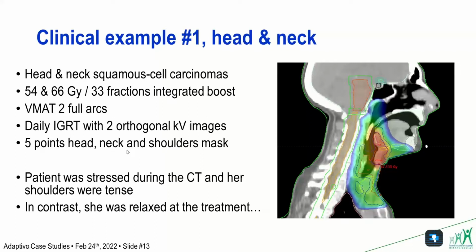The problem with this case is that the patient was very stressed during the acquisition of the planning CT, and her shoulders were very tense. But in contrast, when we wanted to treat her, she was very relaxed and the shoulder positioning was not the same.